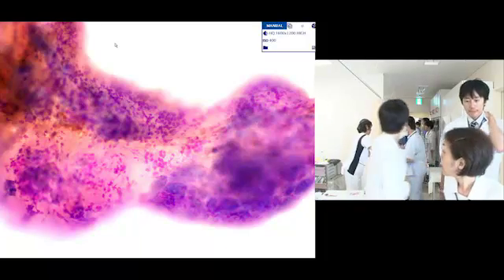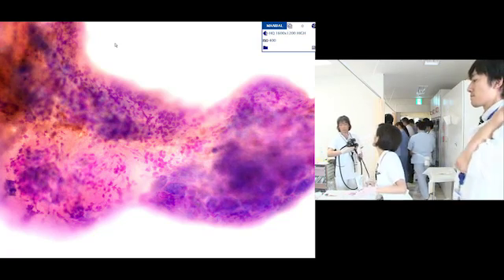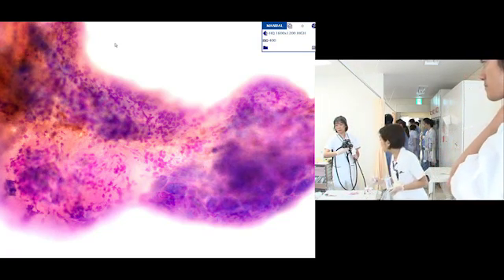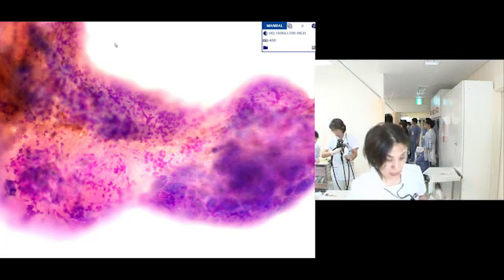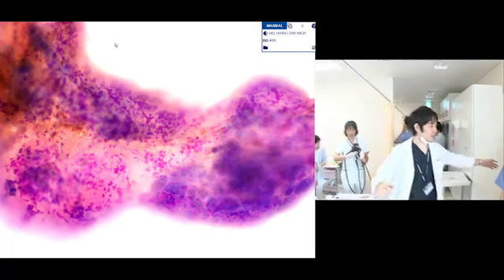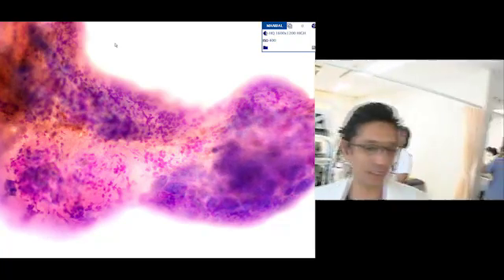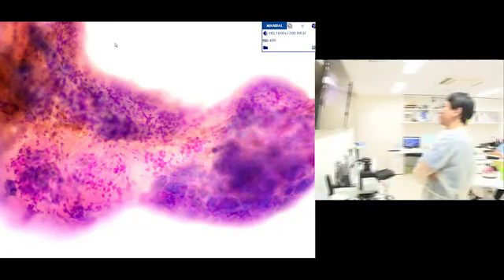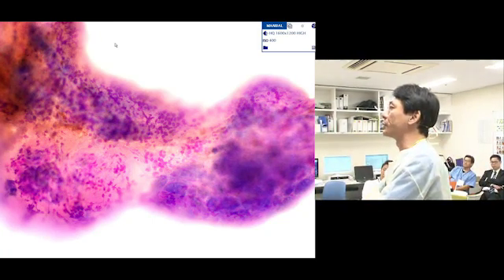I see. For the specimen we take, we can just say that some cell component is acquired. Because today the pathologist is not in this hospital, tomorrow we provide the cytology and the histology for the pathological examination. So maybe we can show you the result tomorrow.